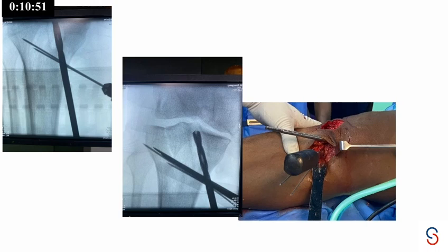I'm concerned when your ascending osteotomy has happened, is there a Takeuchi type 3 fracture that has happened out there? Yeah, exactly. I'm coming to that. So when you're doing these cases, is it better to use an angle stable plate? Is it better to make sure the hinge is well compressed, and therefore probably a staged procedure is better so that all these implications can be handled? So what was your experience you could just share?